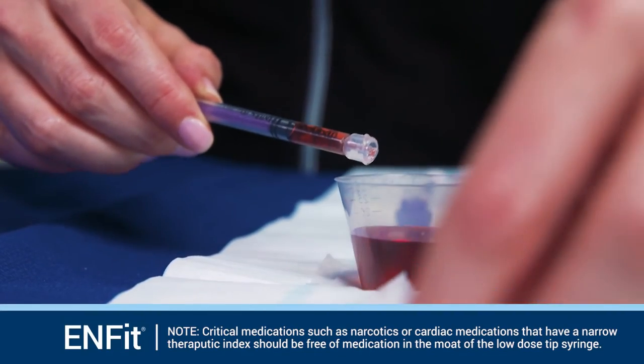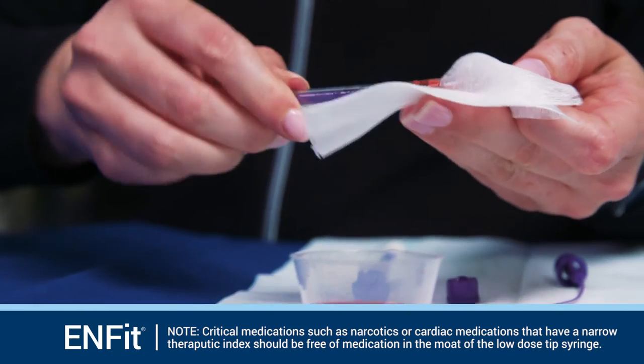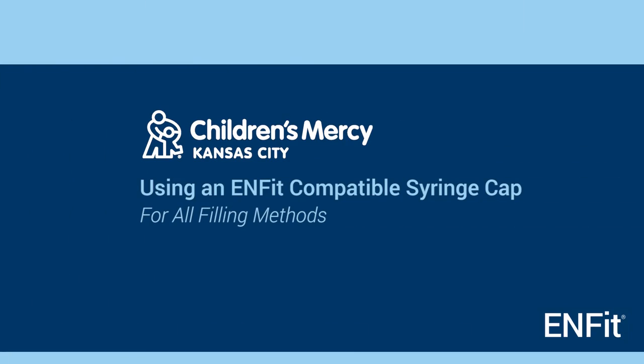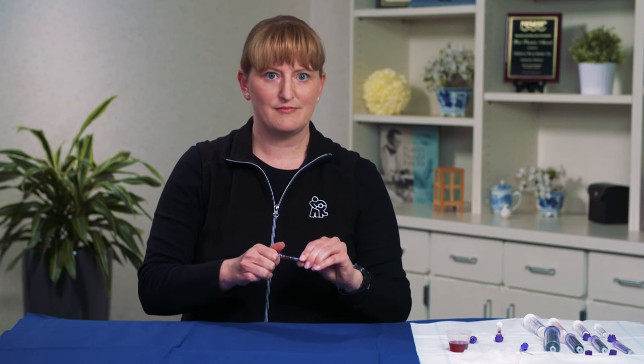For thicker fluids, use a clean cloth to gently wipe the outside and around the tip of the syringe to remove extra fluid. If the dose will not be administered immediately, place an ENFit compatible syringe cap on the syringe. Work with your pharmacy to acquire ENFit-compatible syringe caps.